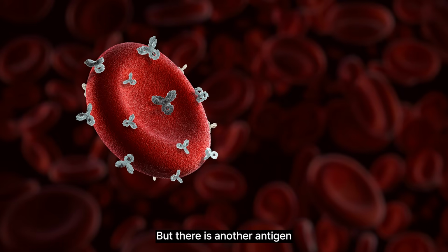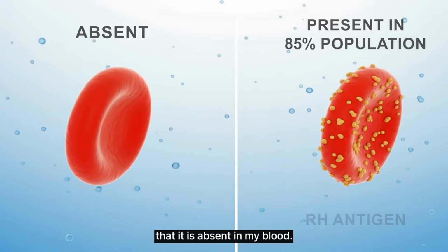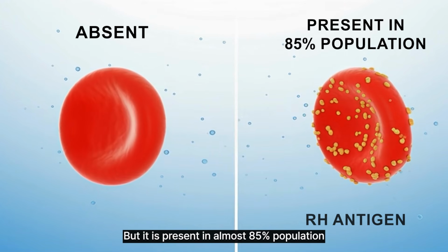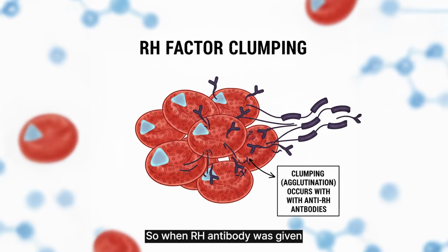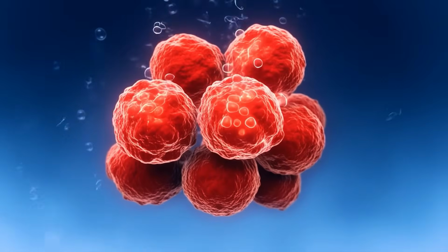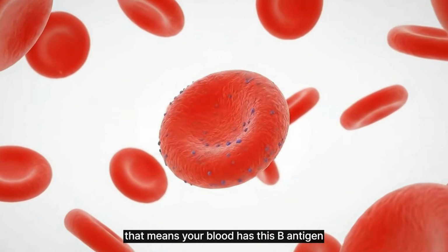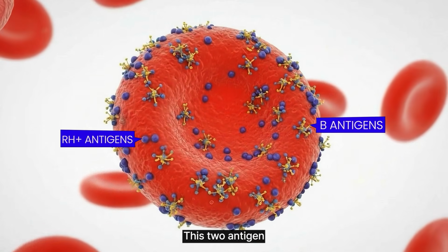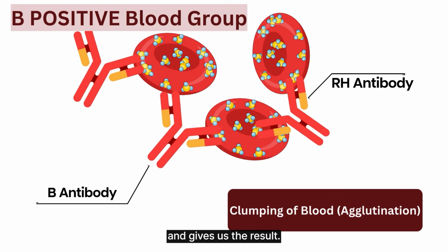But there is another antigen which is absent in my blood, though it is present in almost 85% of the population, and that is the Rh antigen. When Rh antibody was given, this Rh antigen binds to the blood and clumps it. So if you have B positive, that means your blood has the B antigen and the Rh antigen. These two antigens interact with the antibody and give us the result.